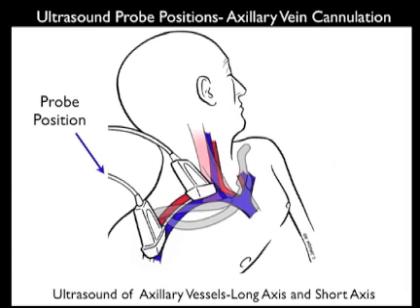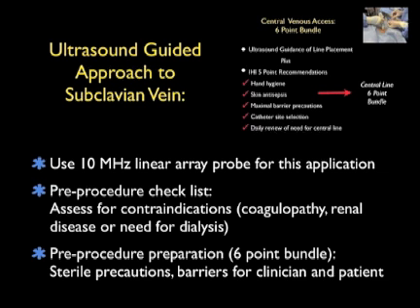To best image the axillary vein using ultrasound, we place the probe on the lateral chest wall. Here we see the probe applied in a longitudinal or long axis orientation over the axillary vein. We can also look in the short axis orientation by turning the probe so the indicator is towards the patient's right shoulder — this cuts the vessel in cross section, making it appear like a circle. For this application we'll use a higher frequency 10 MHz linear array probe. Because we're performing this in a dynamic real-time guidance technique, we'll want to put a sterile sheath over the probe to maintain sterile precautions throughout the procedure.